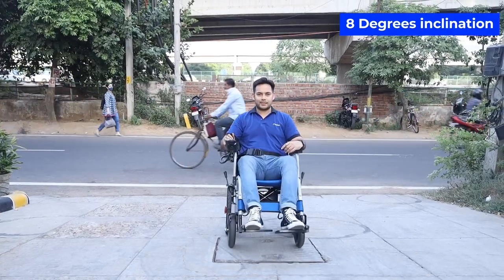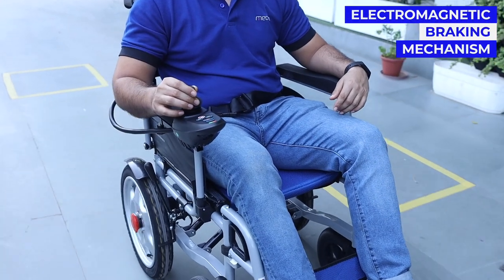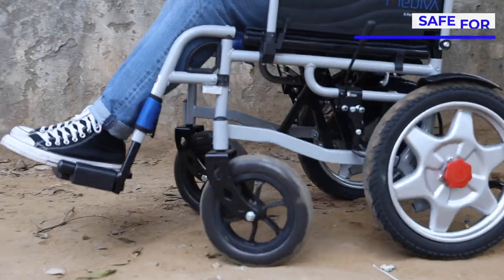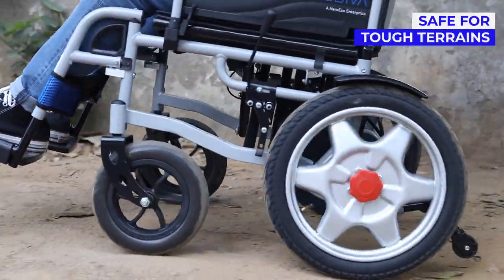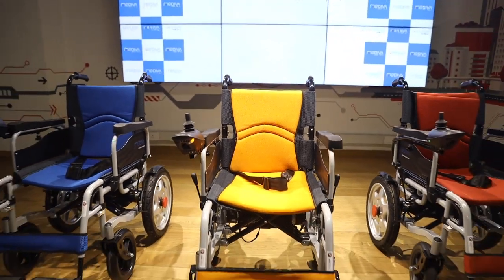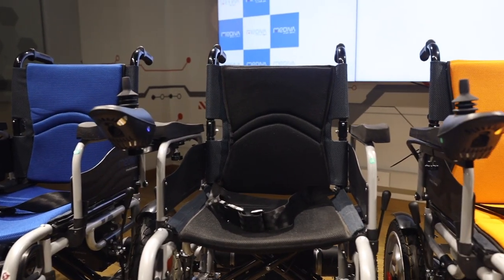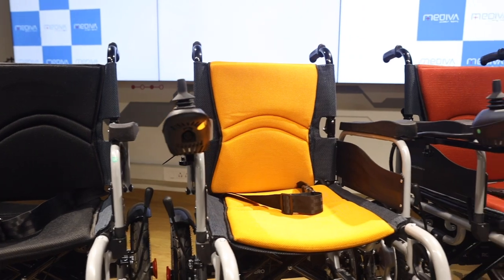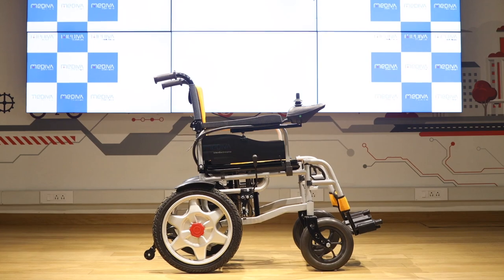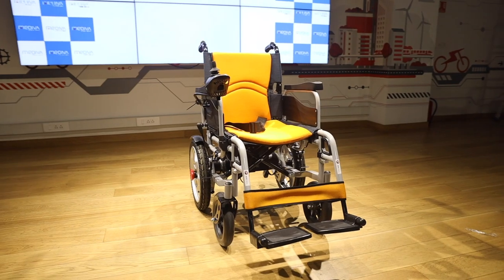It allows an uphill of up to 8 degrees inclination with an electromagnetic braking mechanism, making it safe for tough terrains. Ideally designed for people with mobility issues, the Mediva Electric Wheelchair comes with 4 colour options: Blue, Black, Orange and Red. If you are looking for long lasting ease and movement, then the unique feature-packed Mediva Electric Wheelchair is the right choice for you.